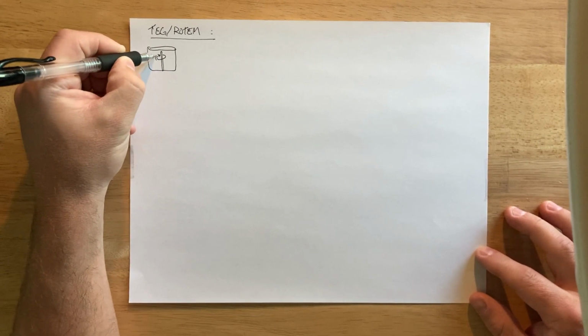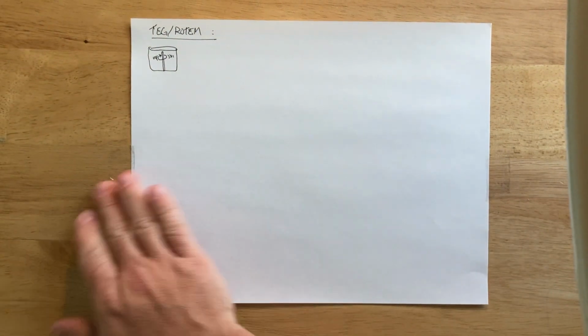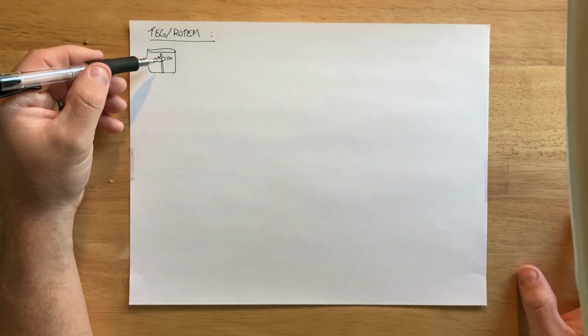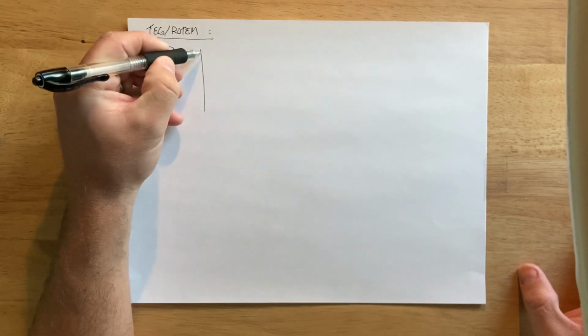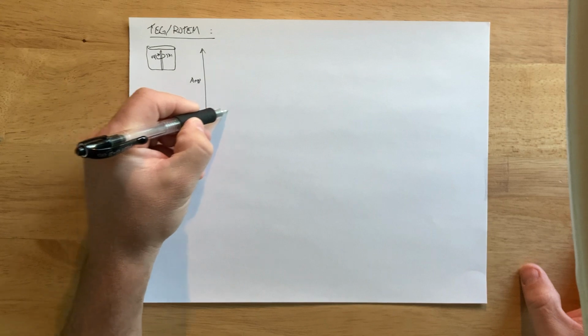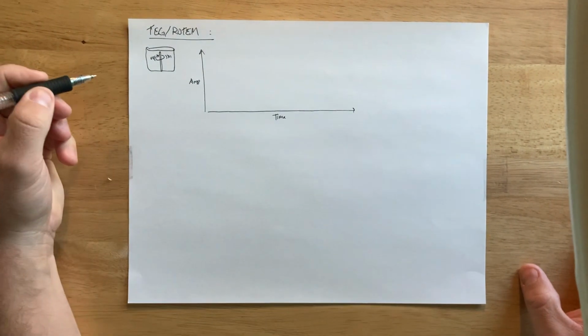As the clotting process happens, it becomes more viscous and causes more force on this pin, and that is translated into a tracing that shows an amplitude on this axis, and then the x-axis being time.